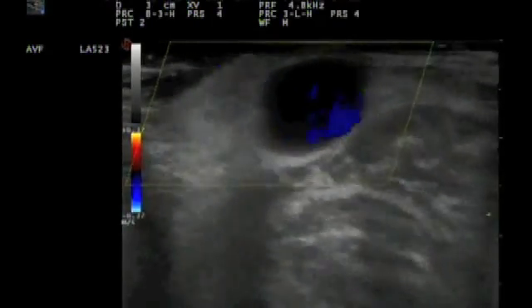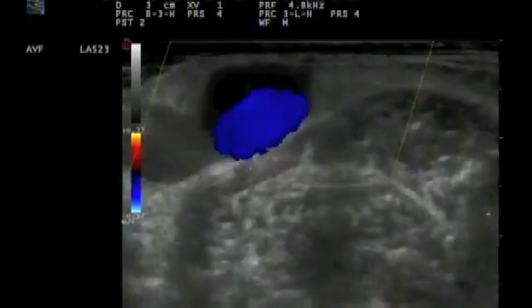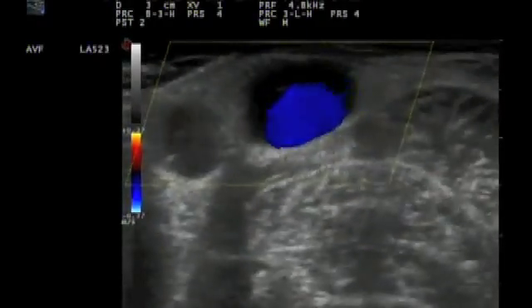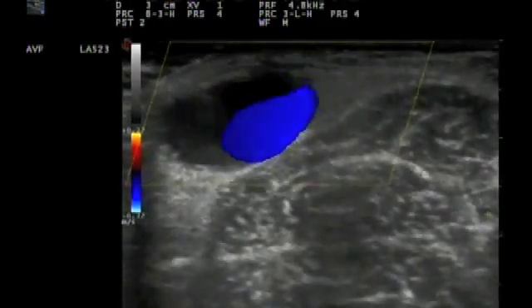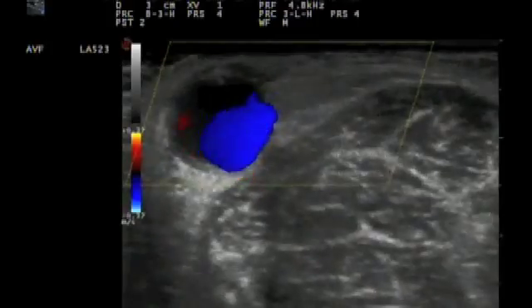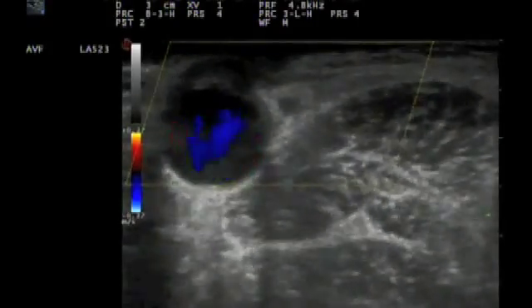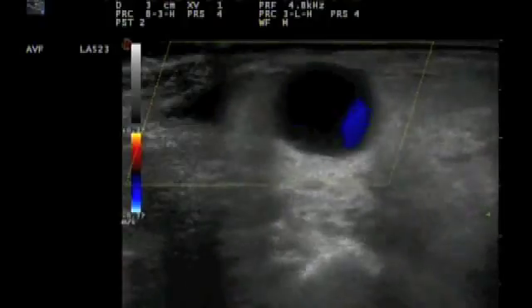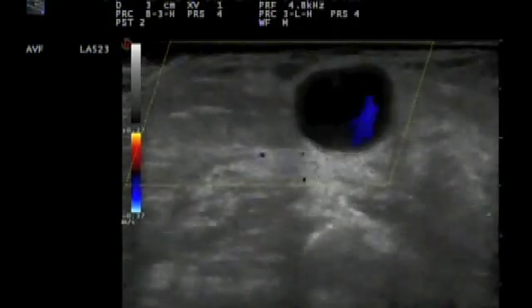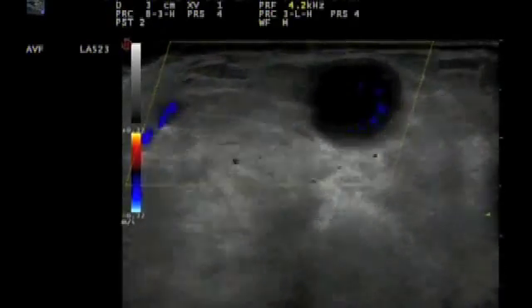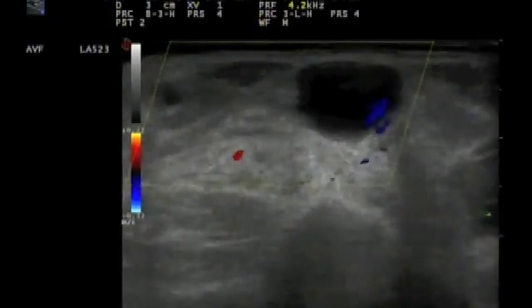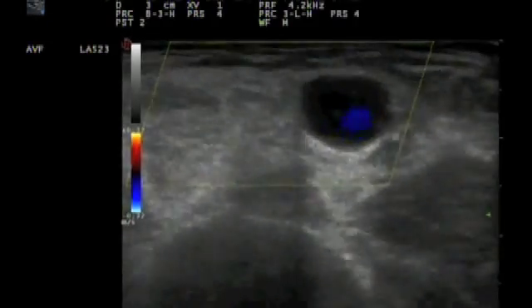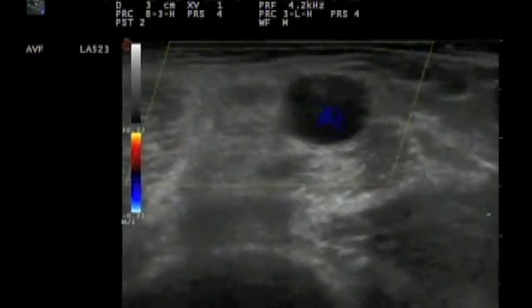And we follow the course of the vein up in the direction of the head. There was a small branch — a collateral vein. There was a bigger collateral vein. Now we are in the area of the shoulder.